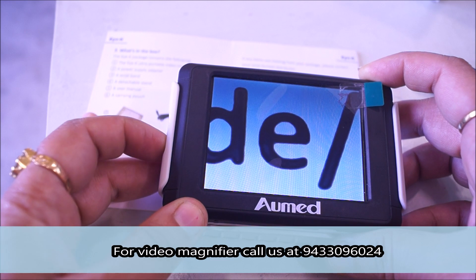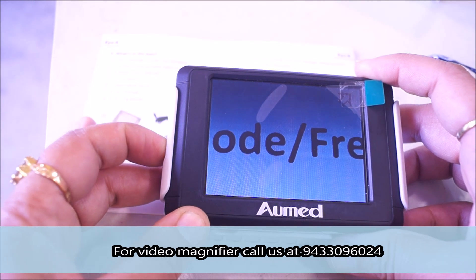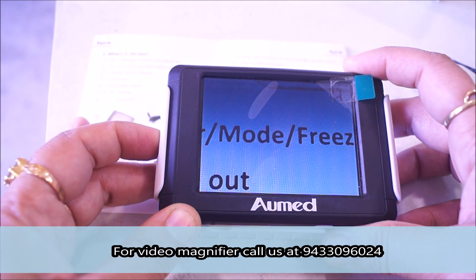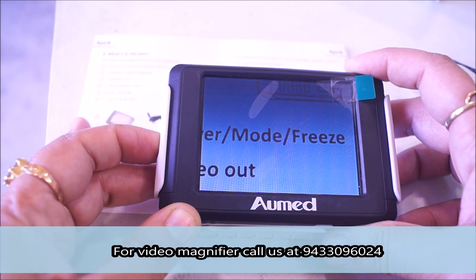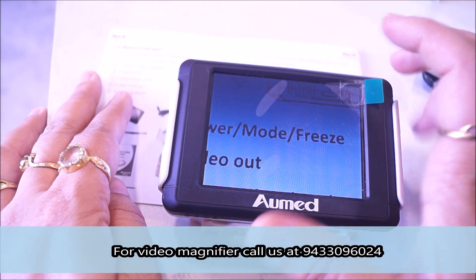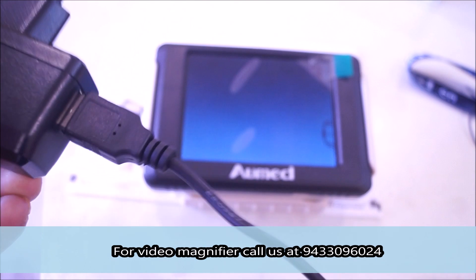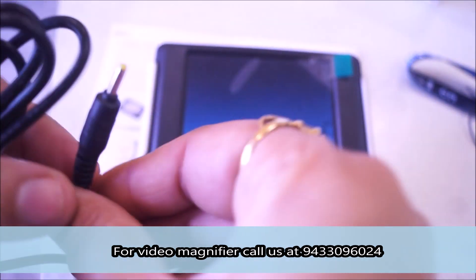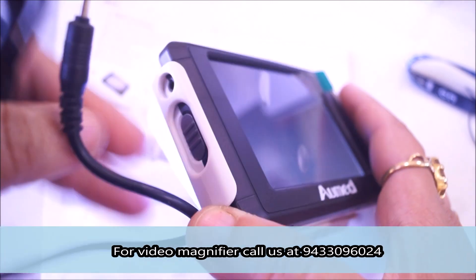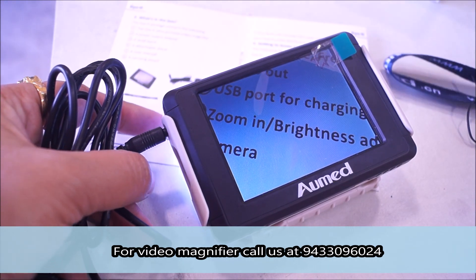From the left side switch you can reduce the magnification. There is also a USB charger included. On the left side of the device there is a charging port where you can plug it in. Usually you charge it for 6 to 7 hours and you can use it for 8 to 10 hours.